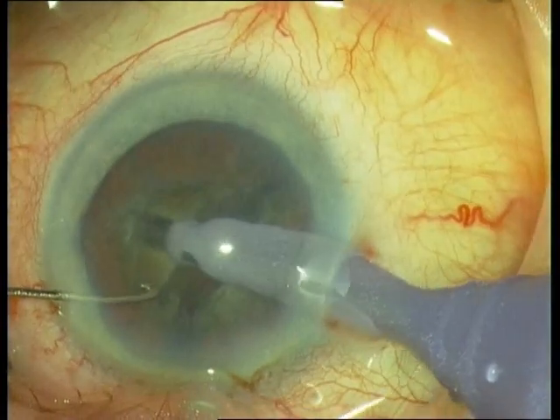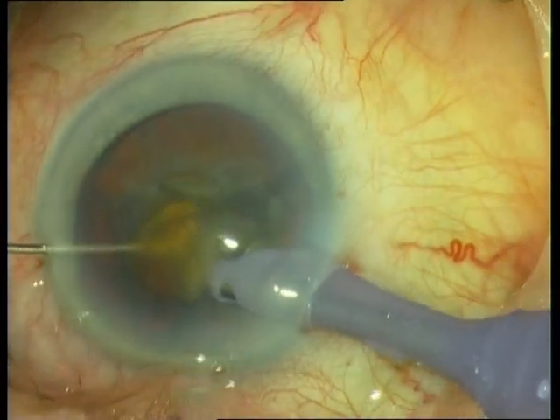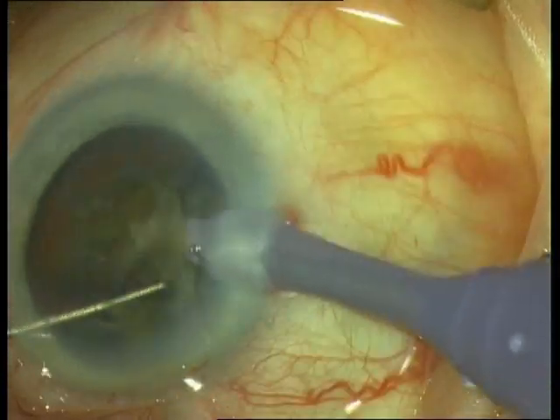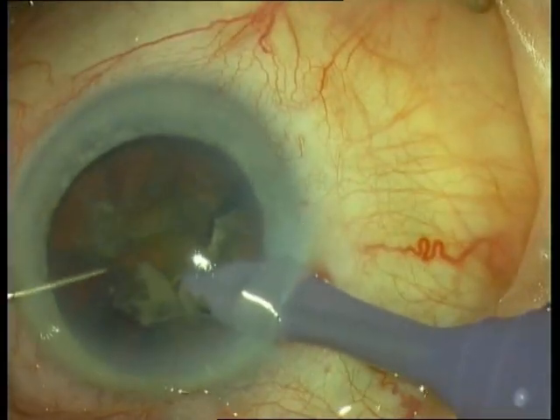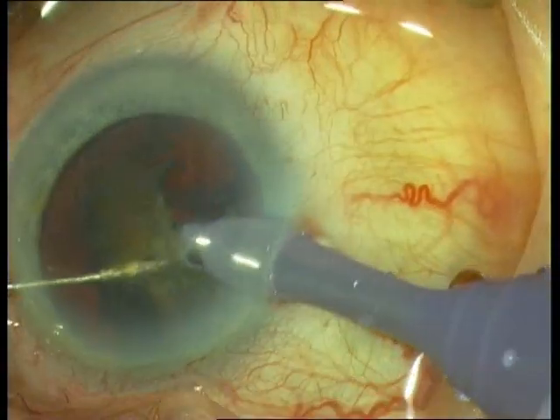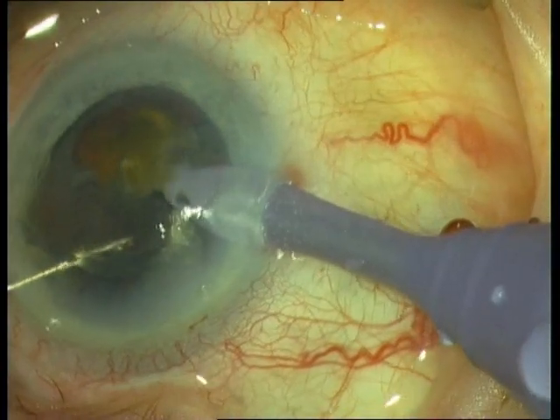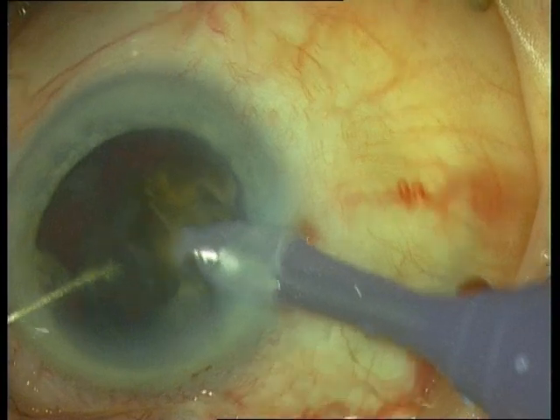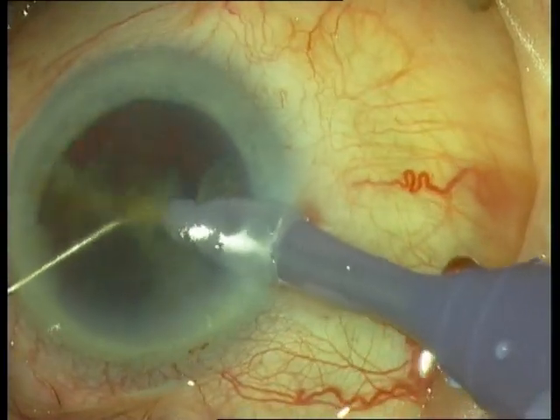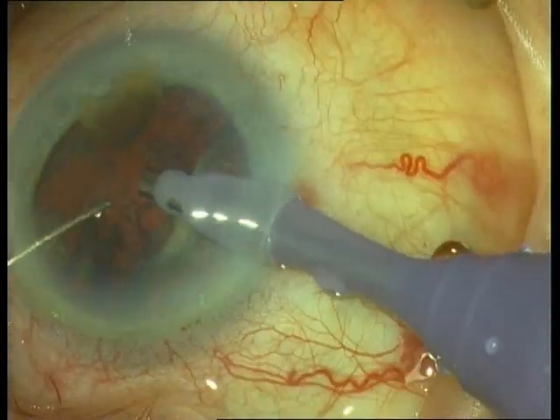The same maneuver with the first half of the nucleus. Next step is the removal of quadrants — FACO mode quadrant removal, high aspiration, high FACO power. Always remove all fragments of the nucleus. Every fragment will cause an anterior uveitis. Don't remove the epinucleus in this step — you need it as a scaffold, as a protection for the posterior capsule.